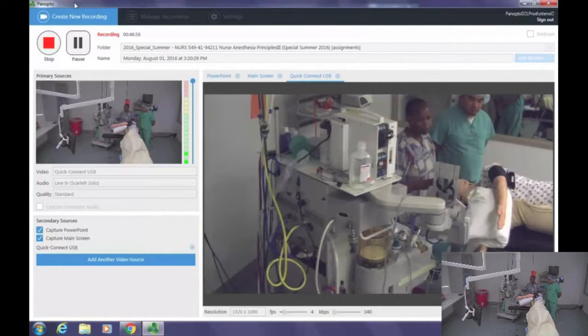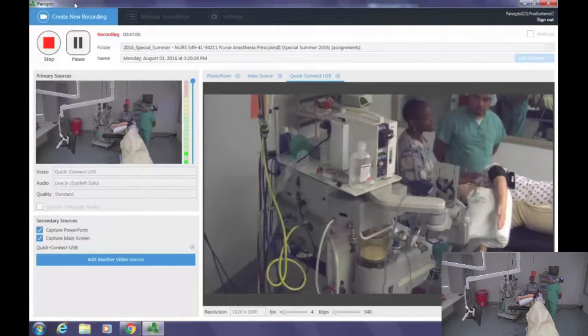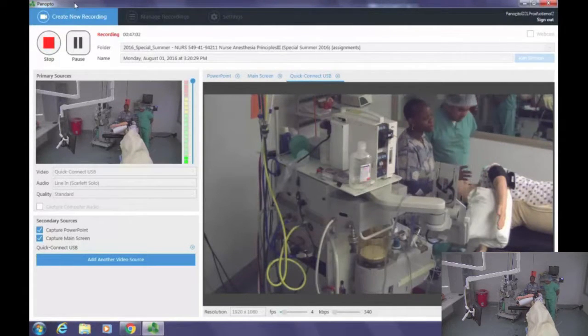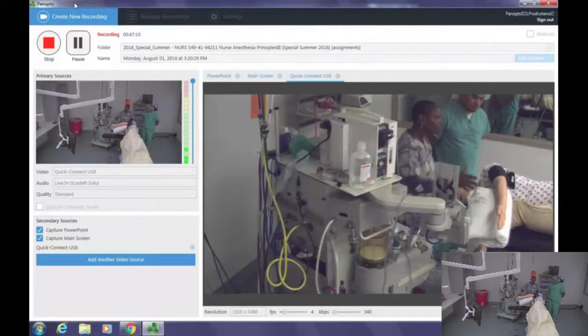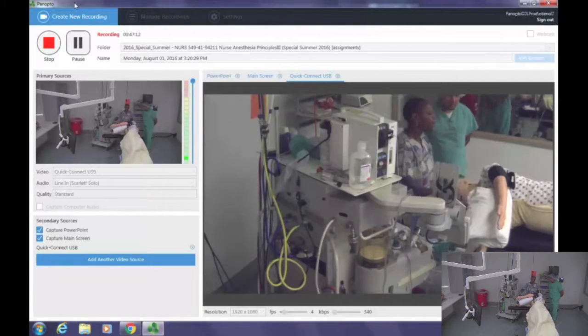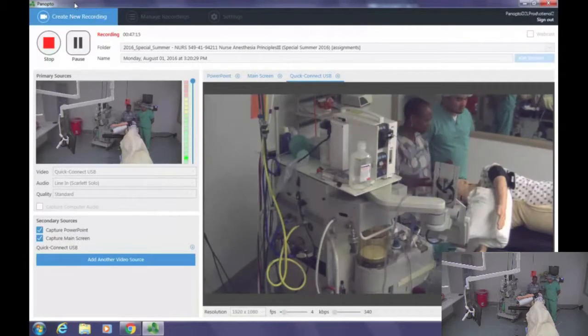Now, before we even think about extubation, once the surgical lung has been expanded, you can go back to your previous setting. So for us, we were on pressure control. We're going to go back to volume control or whatever settings you were on before. And then the chest tube is going to be inserted. We know that we're going to be ventilating 2 lungs instead of 1.